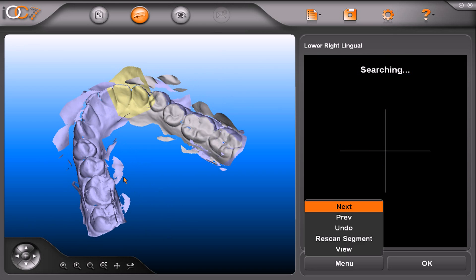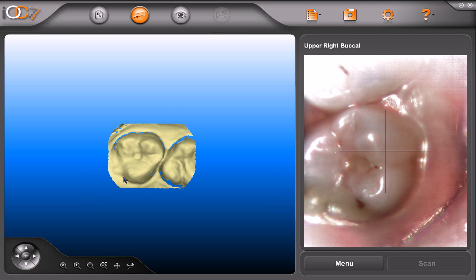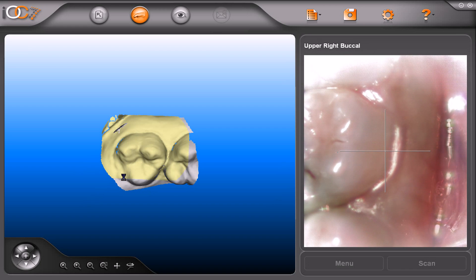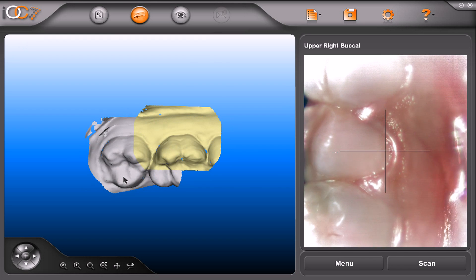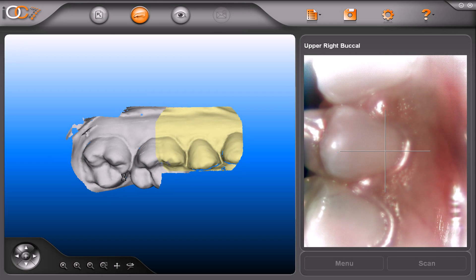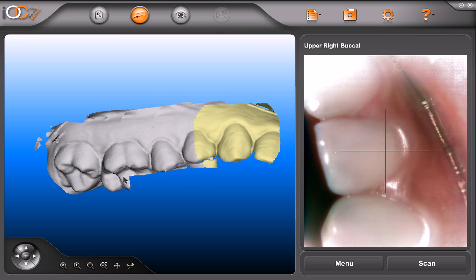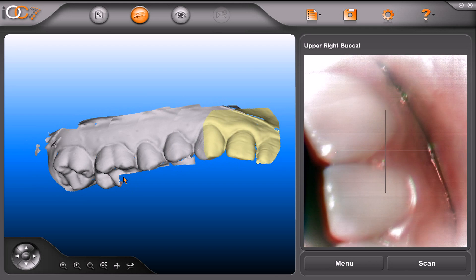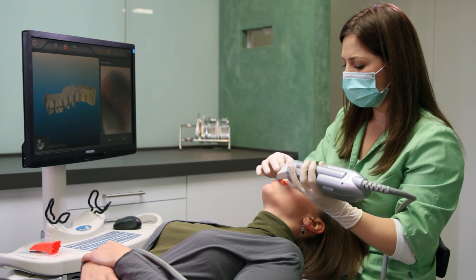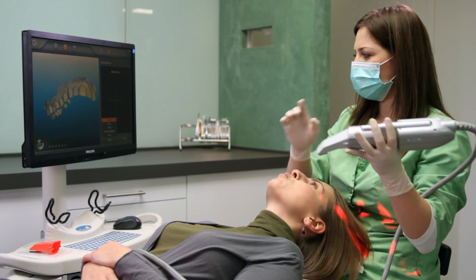Now we move to the next segment to capture the upper right buccal. On the upper arch, follow the same process as the lower. The first scan will be occlusal, then roll to the buccal side and scan in the mesial direction. Just like the lower, go just beyond the midline in order to capture the areas that may be missing. To finalise, press the pink foot pedal followed by the green pedal for the next segment.